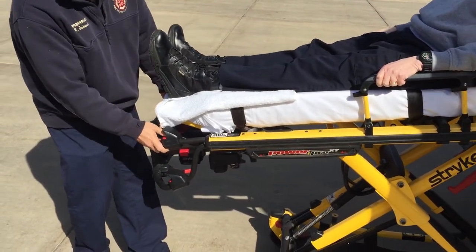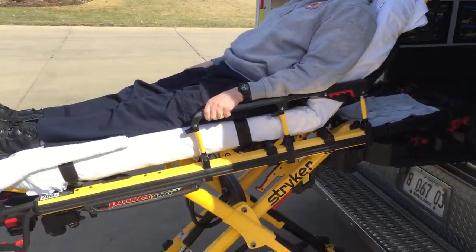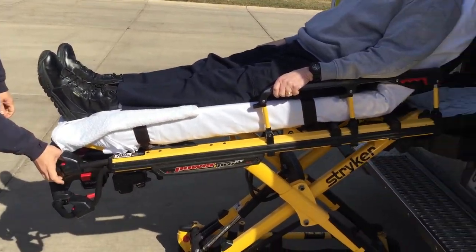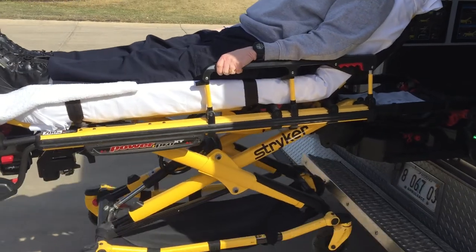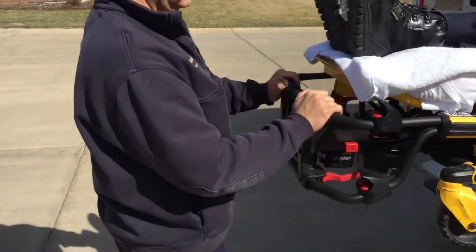In order to load it back up, all he has to do is click it back into place, lift up, and slide it back in. You can see he does this without any stress on his back.